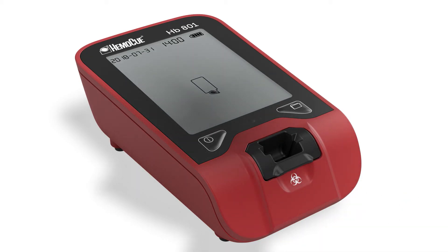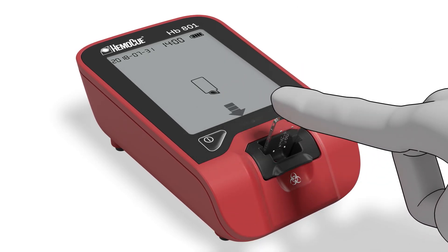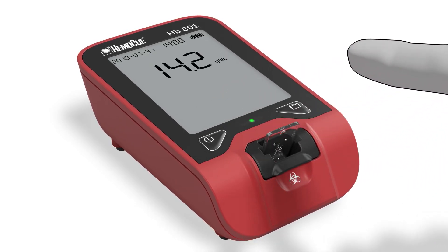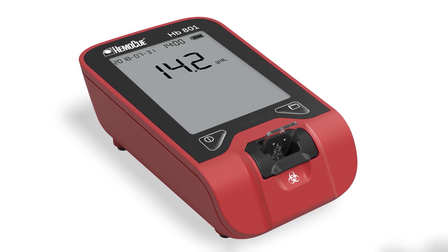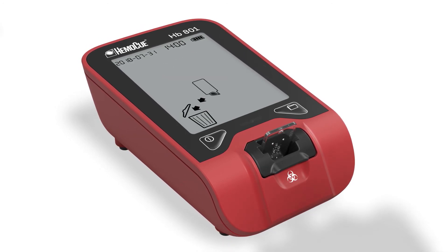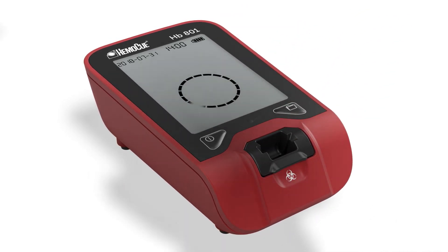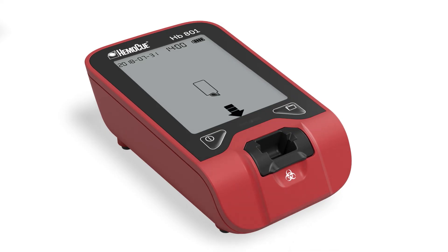Then insert the micro-cuvette and press it down into position. Once the result is displayed, remove and discard the micro-cuvette. The result is displayed for 10 seconds and automatically saved. The instrument is now ready for a new test.